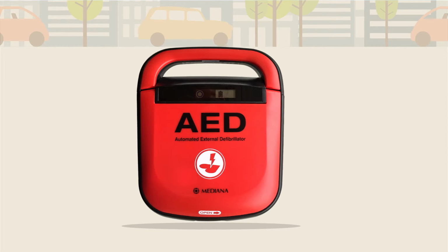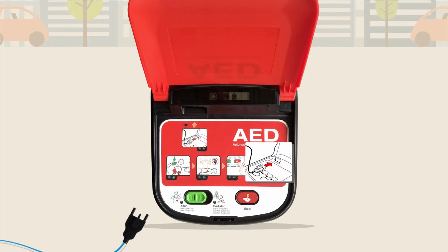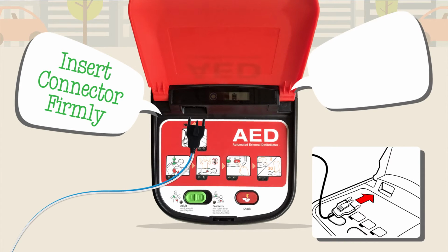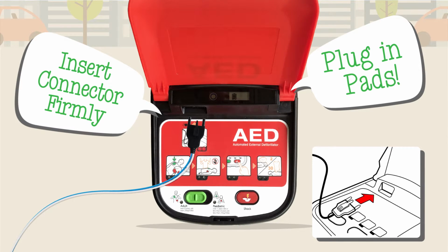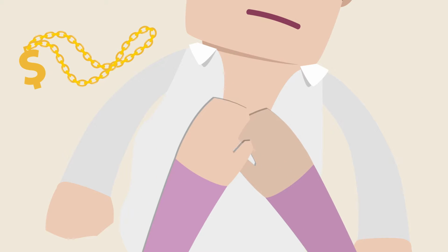Open the lid of the Mediana AED. This will turn the power on. The electrode pads are pre-connected, but if for some reason they are not, the machine will tell you to insert connector firmly, plug in pads. Once this is done correctly, the machine will tell you to remove clothes from the patient's chest.